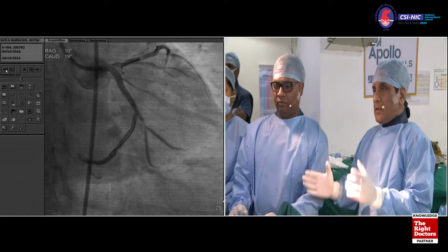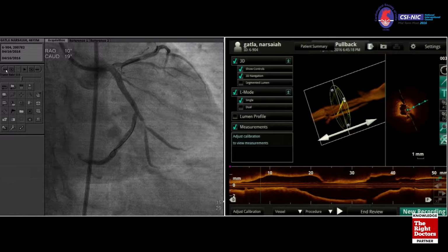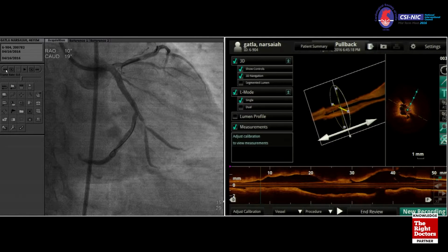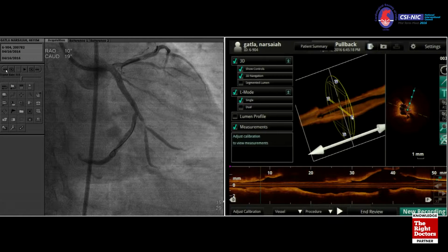The lesion was less than 30% of the side branch. You stent the main vessel, and you see the side branch closes. Clearly, in those, that number is less than 10%. But still, what are the predictors? One of them is plaque on the opposite side of the bifurcation, and then of course it shifts. And what we have shown by the OCT and other analysis is that it is usually lipid plaque.